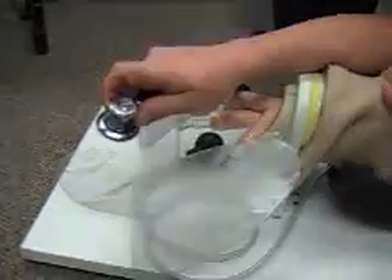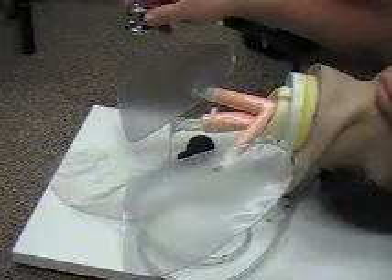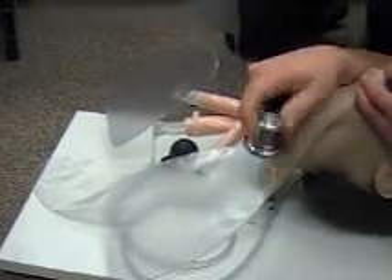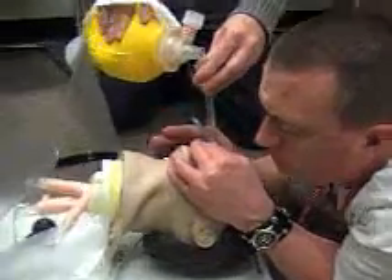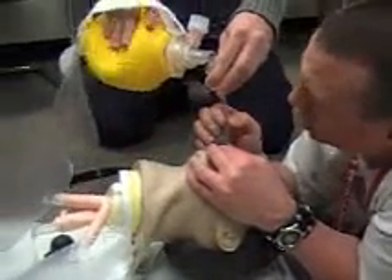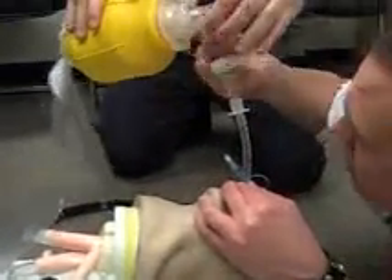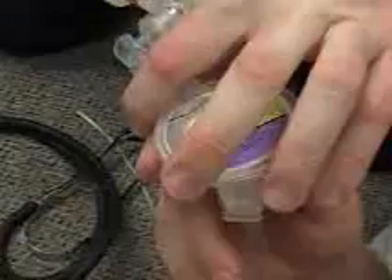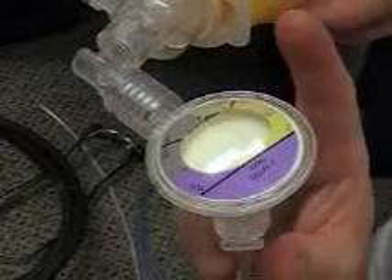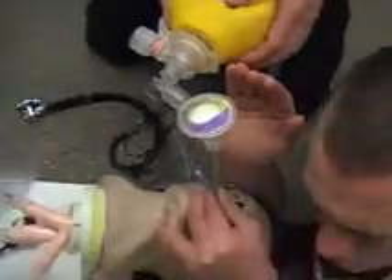Once again I'm going to reassess breath sounds. Listening to epigastric — hoping for no sounds. Lower left lung — I do hear lung sounds. Lower right is present. Upper left is present. Upper right is present. That means I have confirmed tube placement through two methods: visualization of the vocal cords and breath sounds. I'm also looking for misting in the tube, which confirms placement. I can also use my CO2 capnographer — yellow is yes, yellow means I do have CO2, purple is a problem. I do have yellow, so I have correct placement.